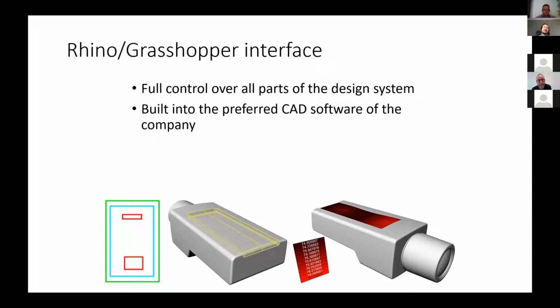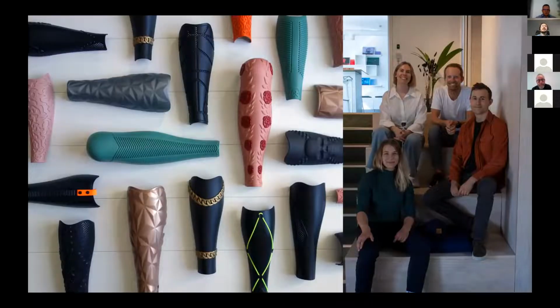So we can use this approach in many different settings, but the setting that I'm going to be focusing on here today is, of course, within the medical sector, and especially within these cosmetic coverings here that fit on top of regular leg prosthetics. So these are not load-bearing, they're rather there to cover the real functional part of the prosthetic. But it gives, of course, a certain look.